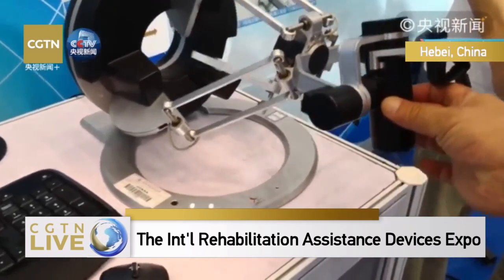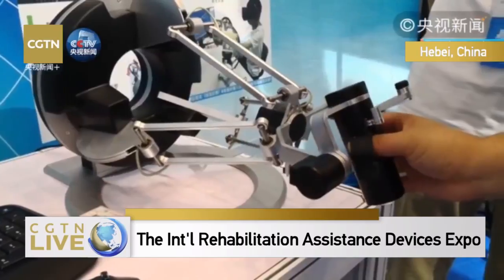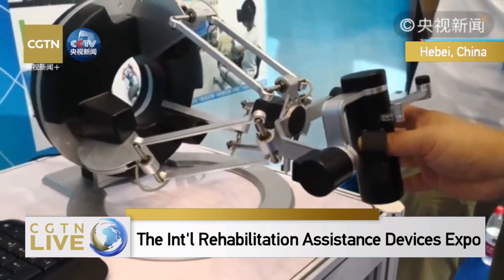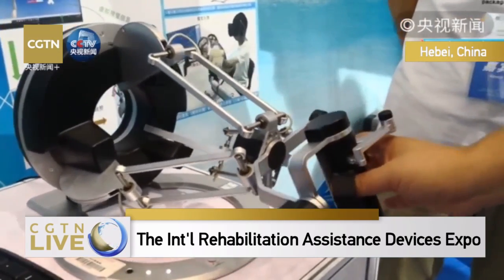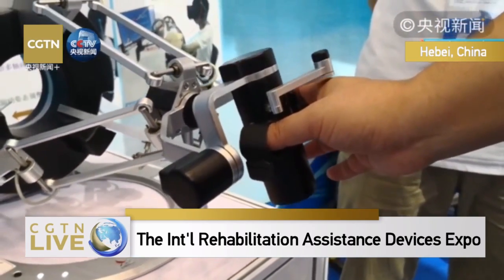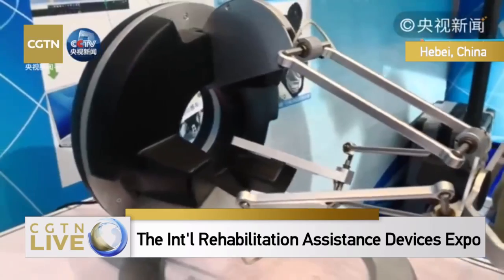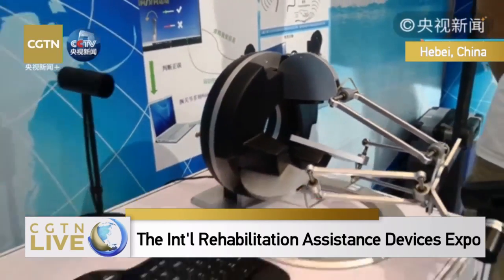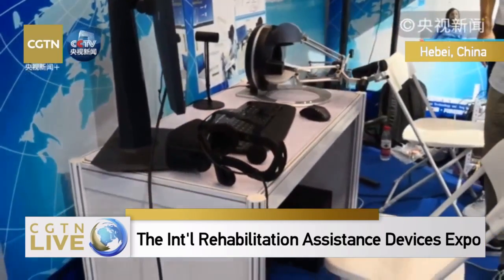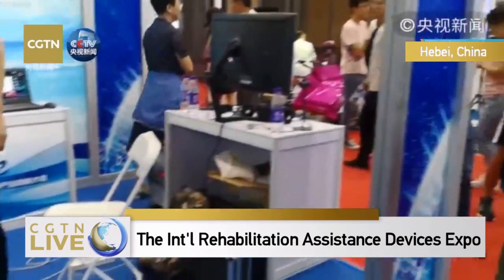This involves a very complicated mechanical system. It has a lot of parallel connections. If you use your wrist to adjust the angle of the ball, it is quite sensitive. With the slight shake of your wrist, you can adjust the angles. This is for the recovery of the wrists.